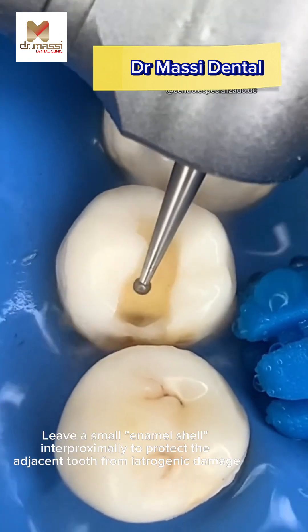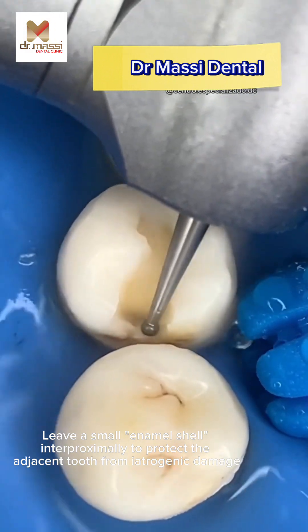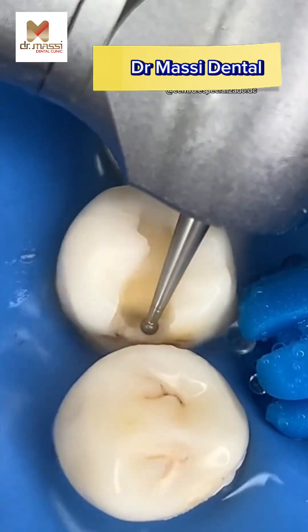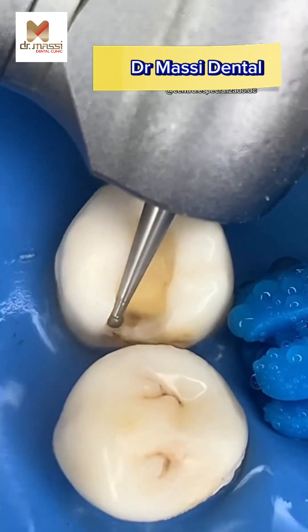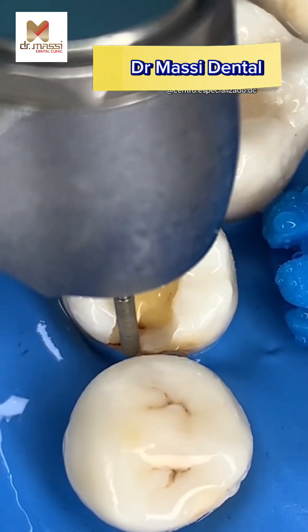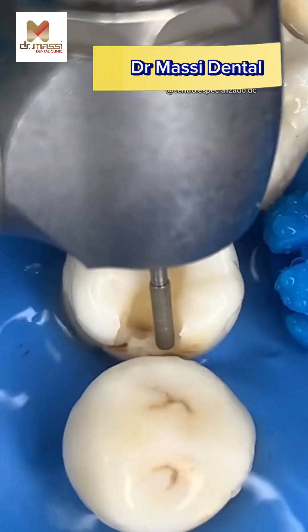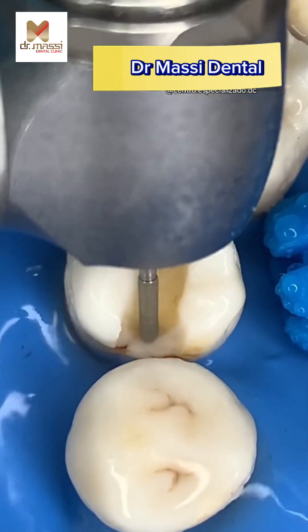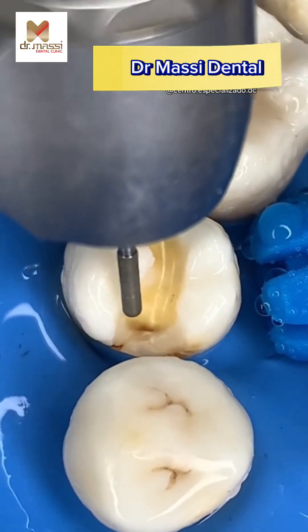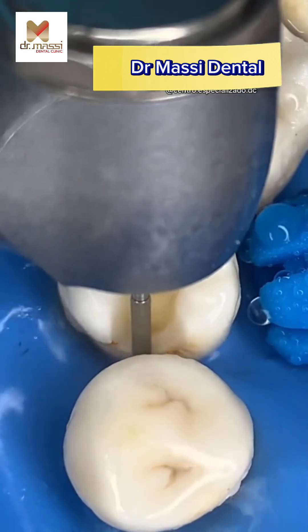Leave a small enamel shell interproximally to protect the adjacent tooth from iatrogenic damage. To create the proximal box, extend the preparation gingivally until the gingival contact breaks. The gingival contact is broken less than 0.5 millimeters. When the gingival contact is broken, the tip of the explorer will pass through the broken contact.